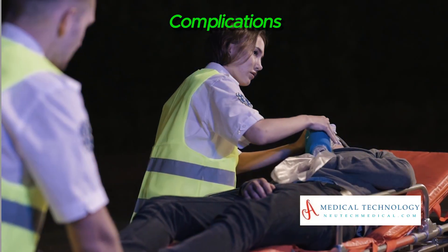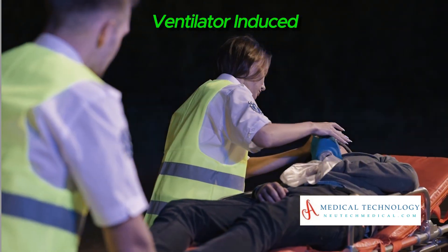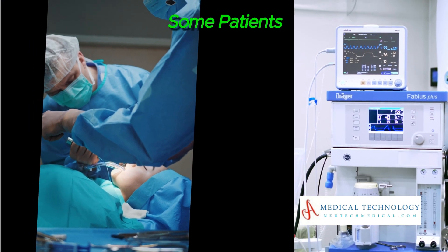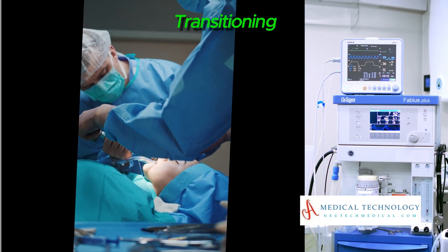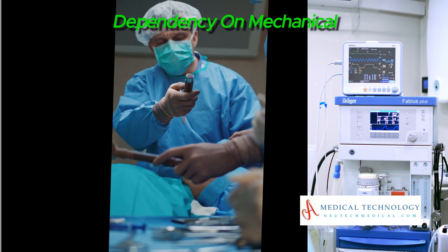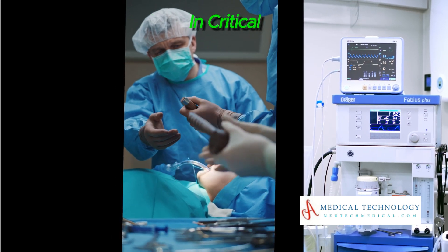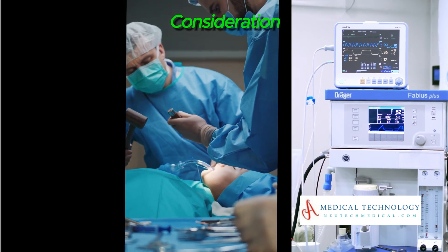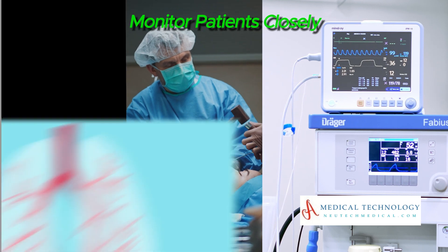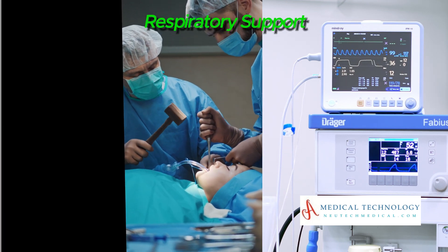Complications related to ventilator use may include ventilator-induced diaphragmatic dysfunction, where the diaphragm weakens over time. Some patients may face challenges transitioning from ventilator support to spontaneous breathing, leading to prolonged dependency on mechanical ventilation. Healthcare professionals monitor patients closely, adjusting ventilator settings to balance the benefits of respiratory support while minimizing associated risks.